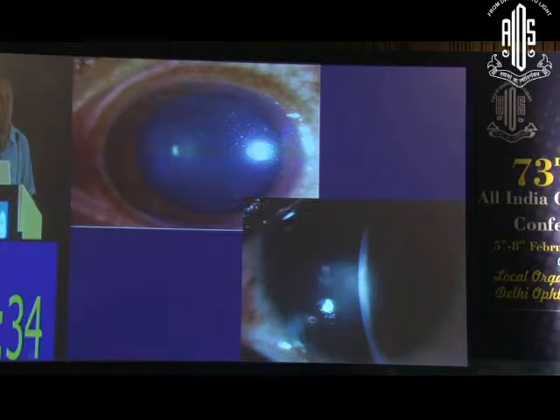Now we have heard Dr. Prasad and Dr. Swapna speaking a lot about this. Does anyone want to describe this? Okay, say this was a 35-year-old man. What do you see over here? What photograph is this? Okay, slit lamp photograph. What do you see over here?